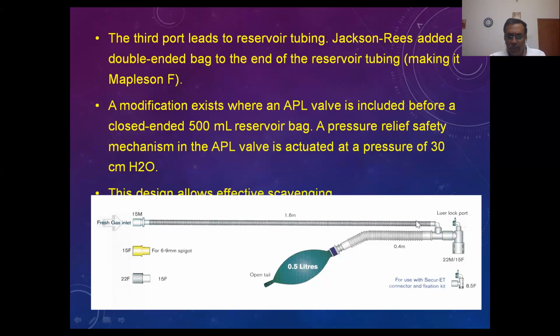The fresh gas flow comes through here during the first phase of inspiration and is delivered to the patient. Okay. During expiration, whatever is expired comes from here and is expelled out. Fresh gas from here also comes in, and the patient is not taking the fresh gas flow. The fresh gas will push away or wash out all the expired air present in the expiratory limb.